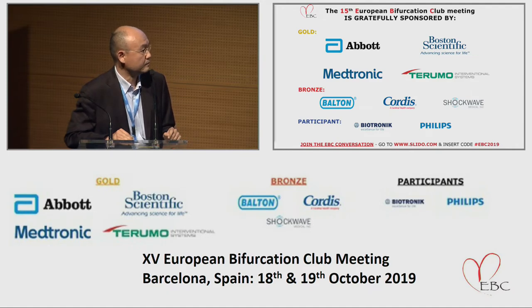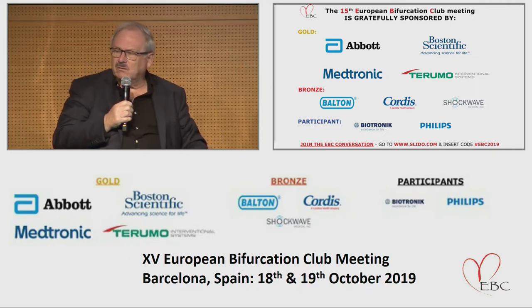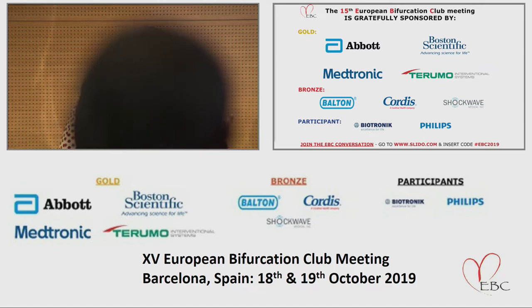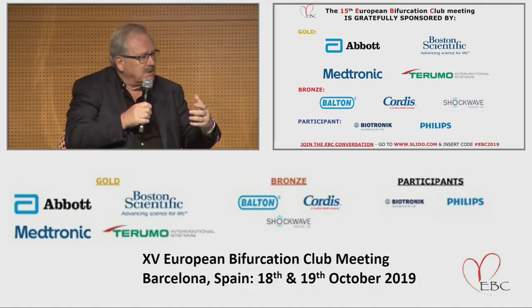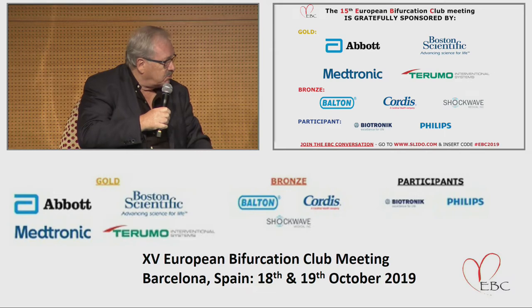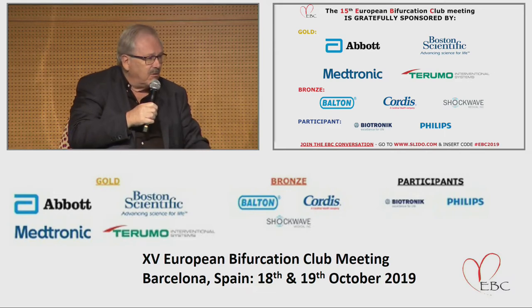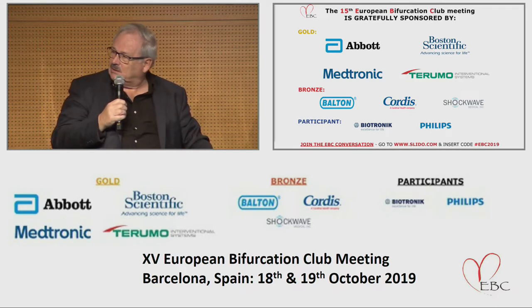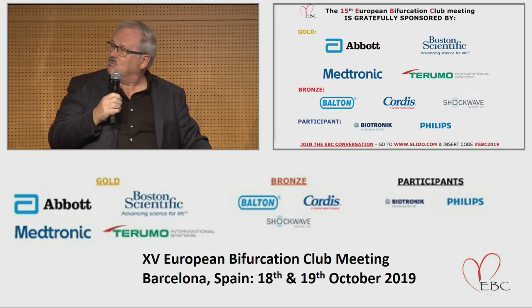Other question? So I think the same remark. We have reached the stage where we have good imaging with 20 micron resolution, and we have so many different patterns that at some time we will have in the lab some kind of program to tell us in advance what we have to do, because now it's the flair of the physician to say, I think I will do this, and it's all trial and error. So we need a little bit more science, and then we'll be able to see exactly which cell we have to dilate and how predictable it is.